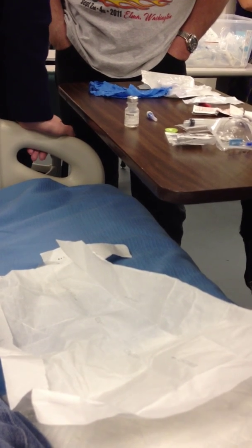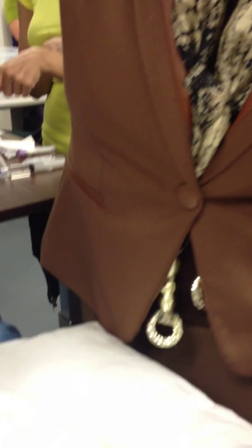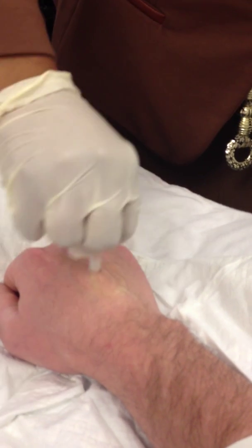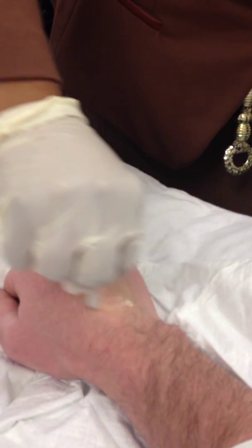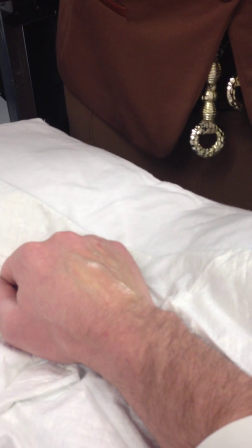I'm going to go ahead and clean my site before I put the tourniquet back on. So, I'm going to clean the site here. I'm going to wipe that dry and get our tourniquet back on.